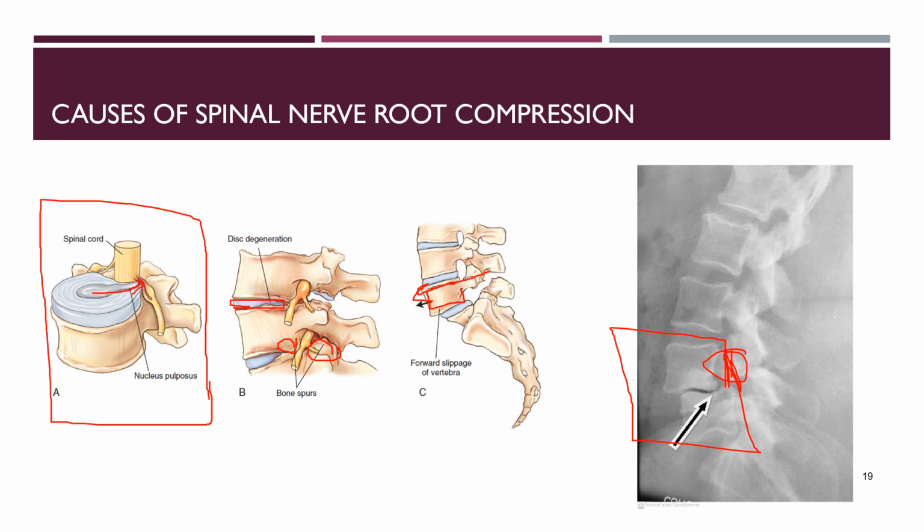So when you're out in clinic and you see this diagnosis of spondylolisthesis, you may want to ask your supervising PT, what grade is it? Is it considered a stable spondylolisthesis, or is it unstable? And that will really guide you in your direction for performing mechanical traction or not.